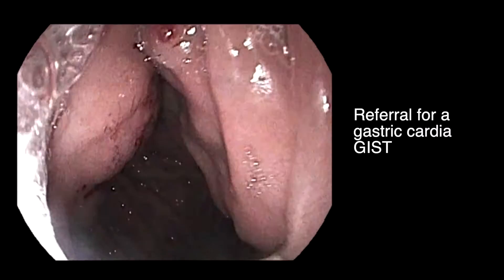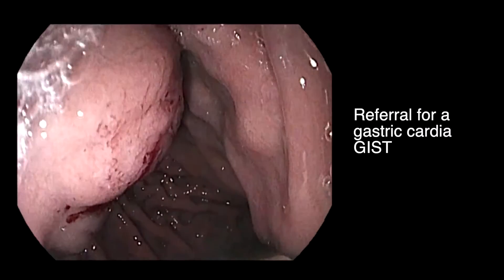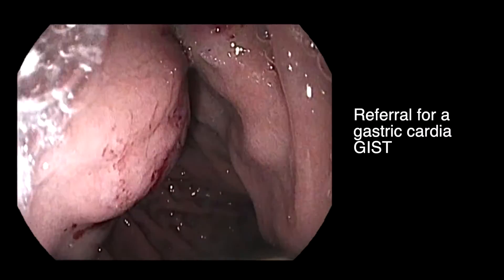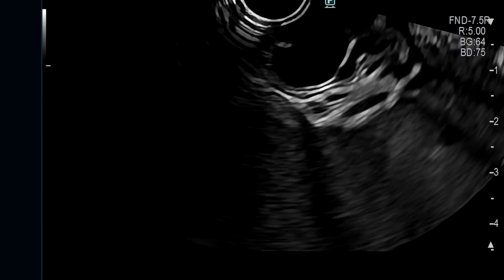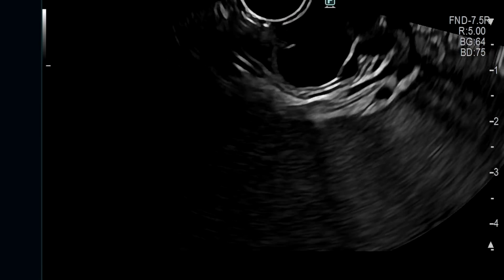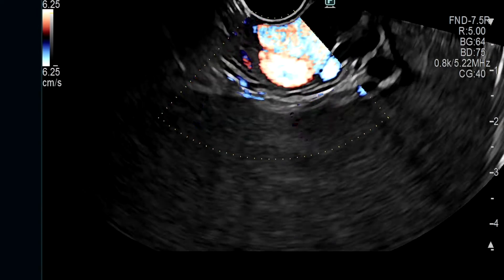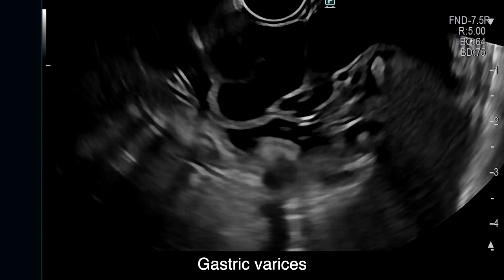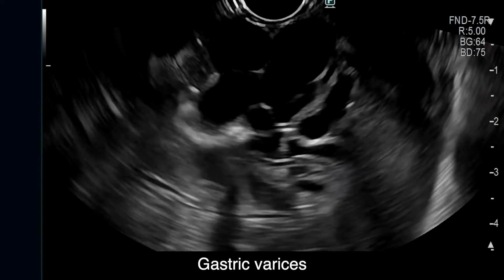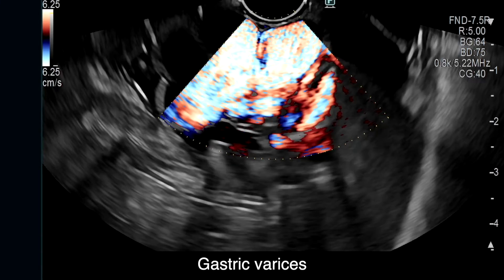This 52-year-old patient was referred for fine needle biopsy of a suspected gastrointestinal stromal tumour located in the gastric cardia. However, endoscopic ultrasound demonstrated faster flow on color Doppler, consistent with a gastric varix.